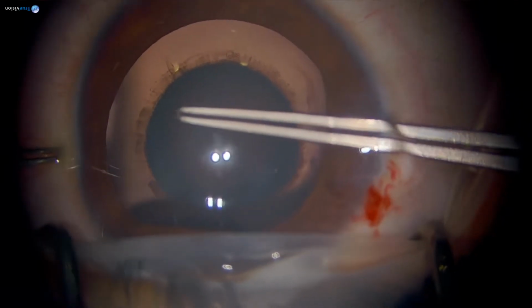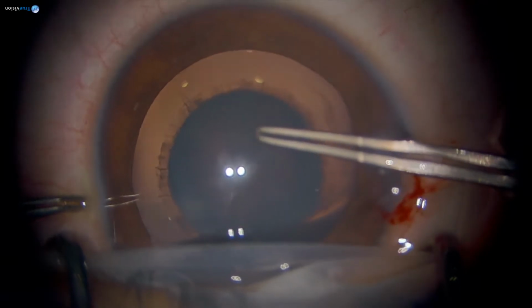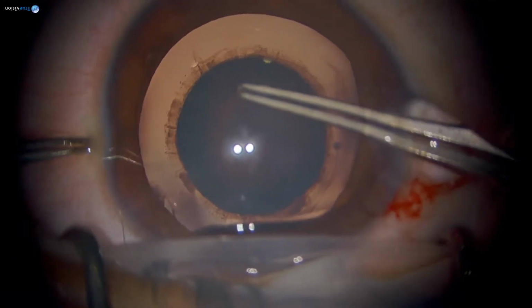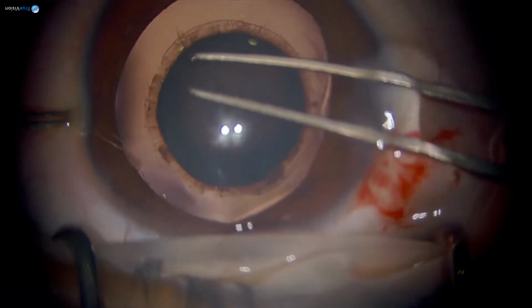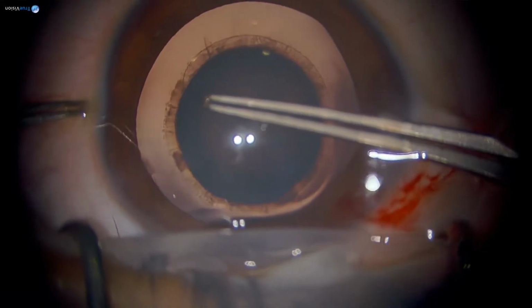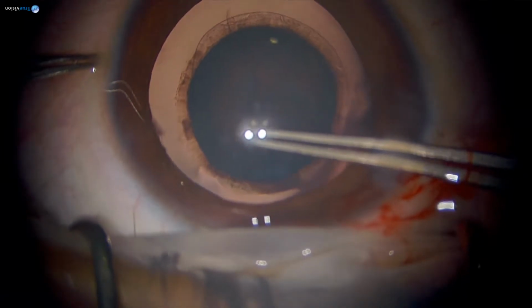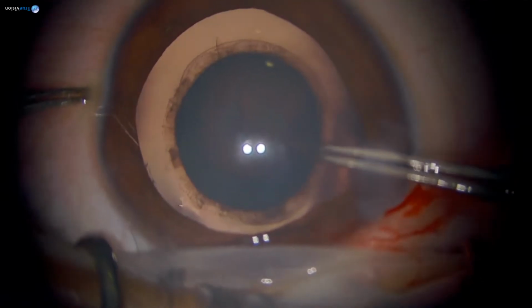You can faintly see the edges here. We have a pretty good visualization here in the classroom. How is the consistency of the capsule? It looks pretty soft. It doesn't look friable or dense. It's quite okay. It's totally different from the infantile cataract where it will be very friable. If you aim at the size of the nucleus, you will go a little bit bigger than that. That's what happens usually.